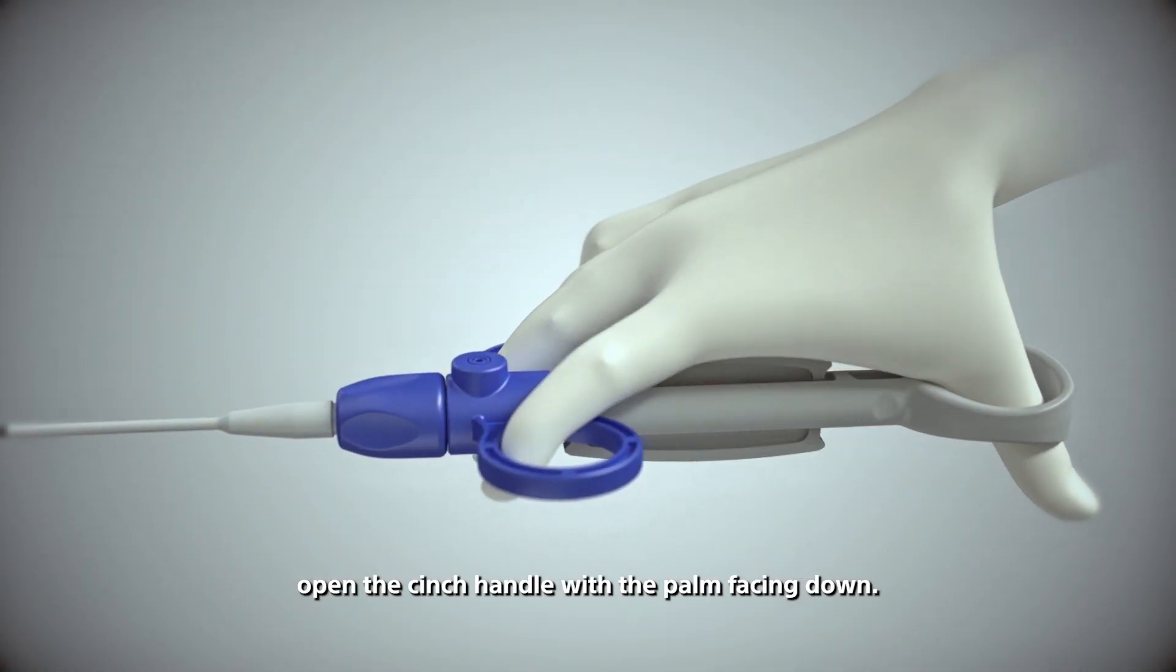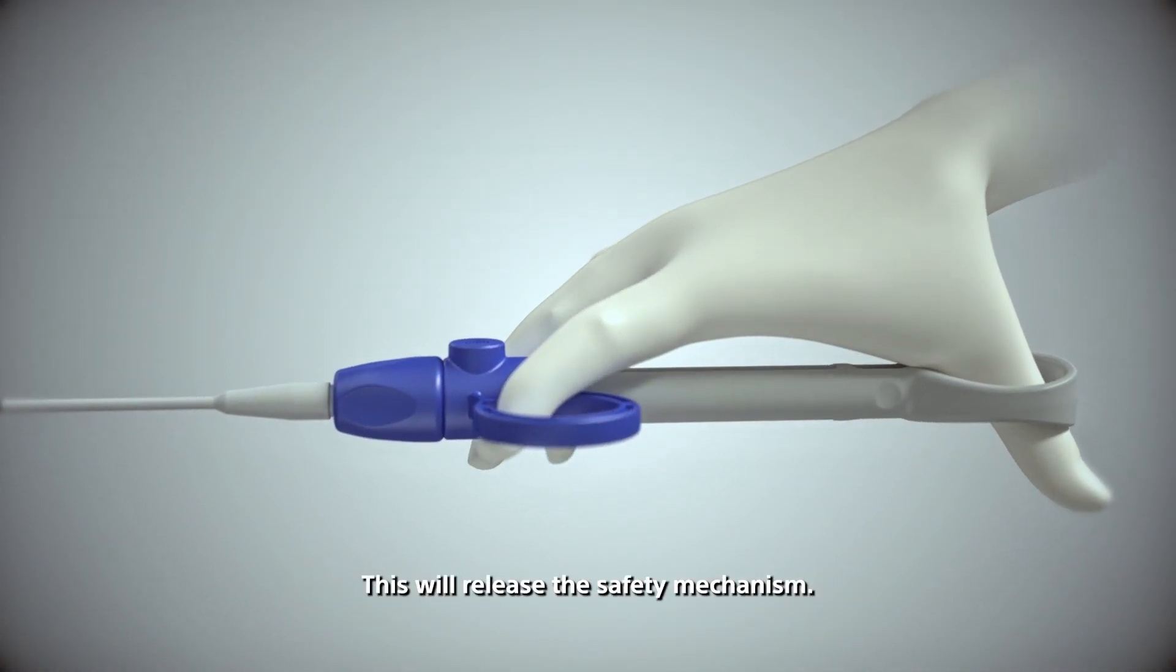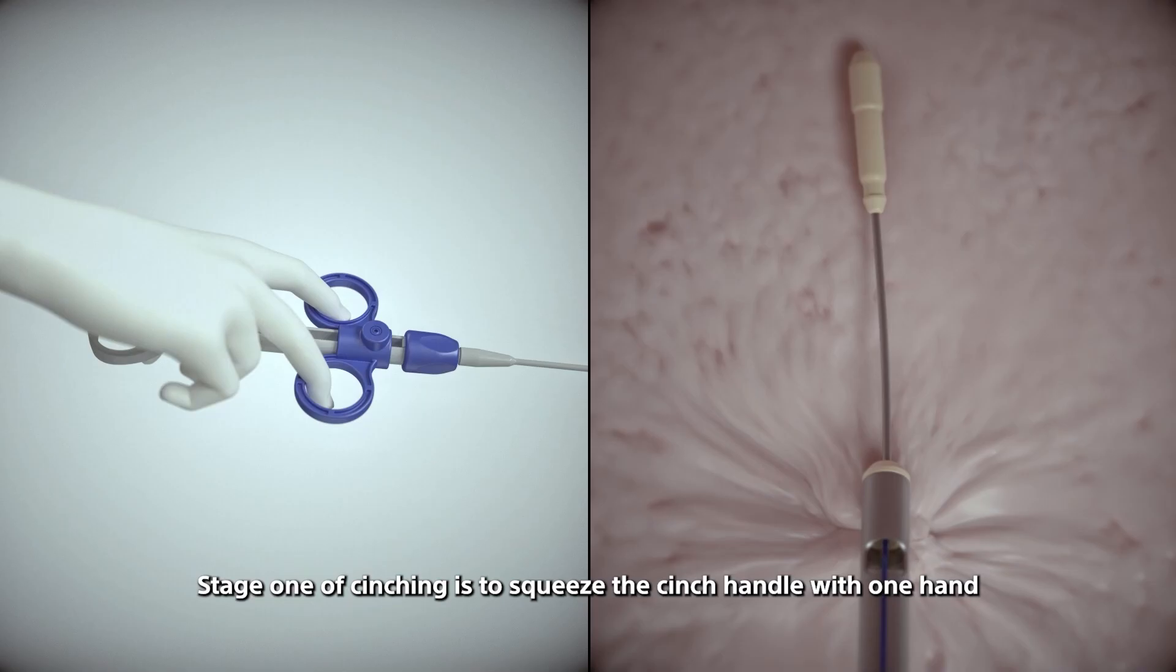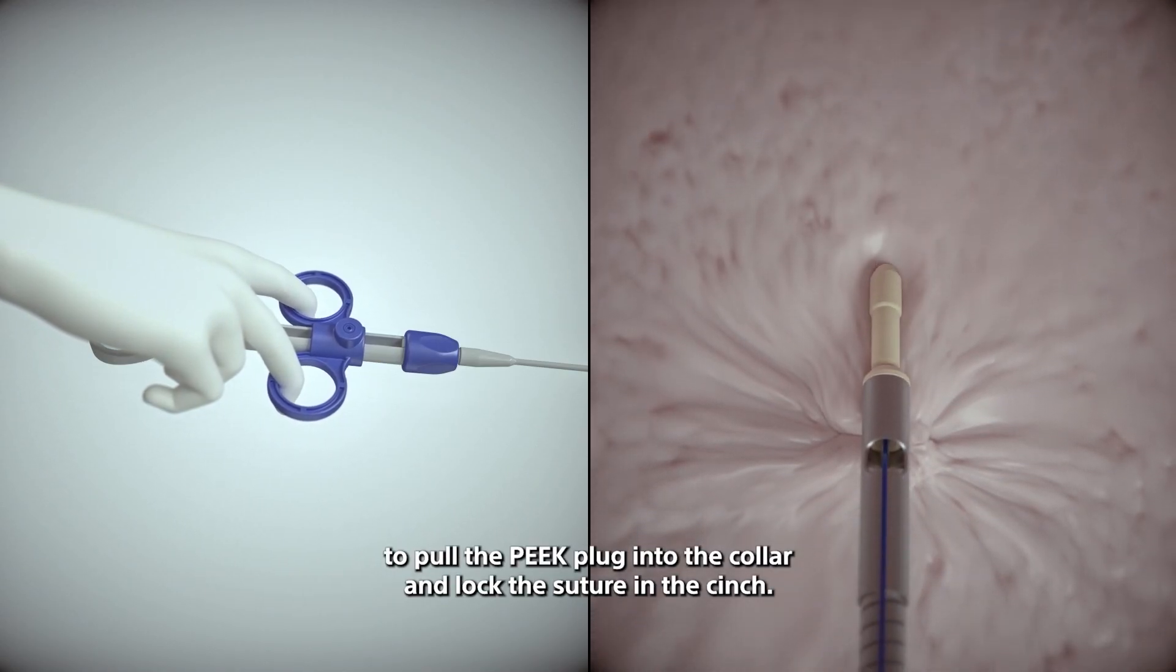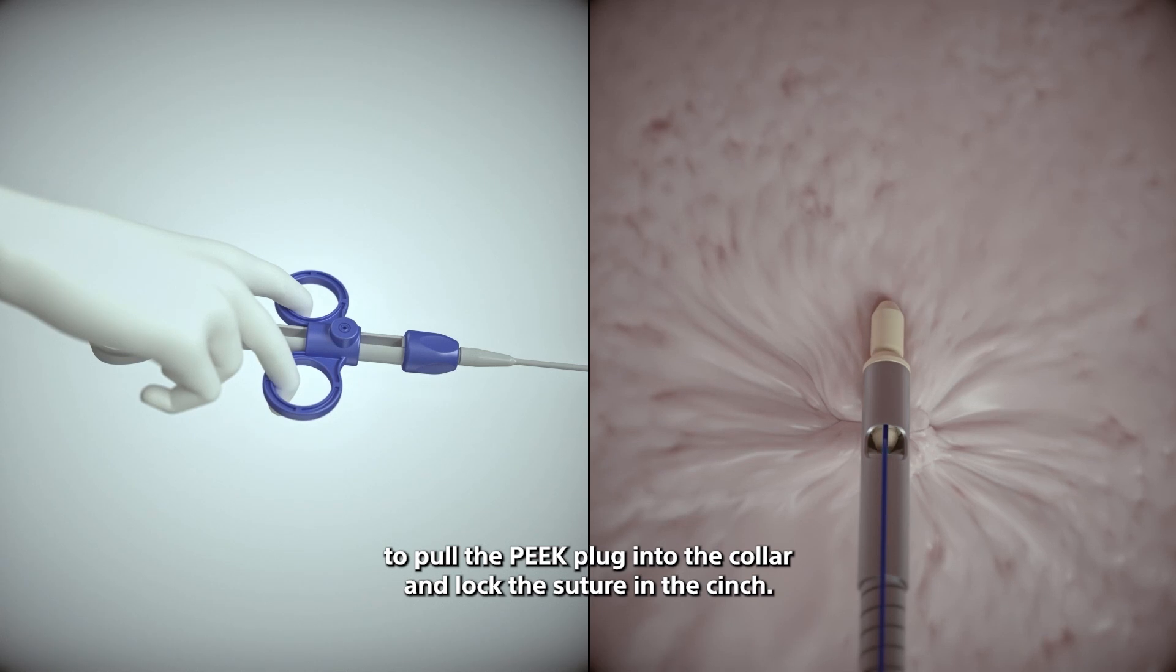This will release the safety mechanism. Stage one of cinching is to squeeze the cinch handle with one hand to pull the peak plug into the collar and lock the suture in the cinch. Stage two of deploying the cinch will require two hands. Continue to squeeze the cinch handle to advance the beaded rod through the peak plug.